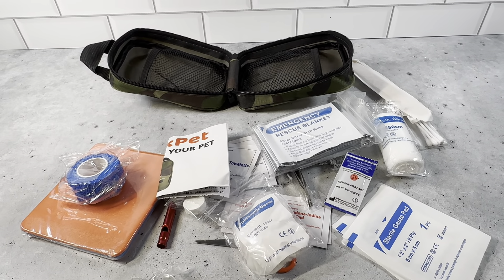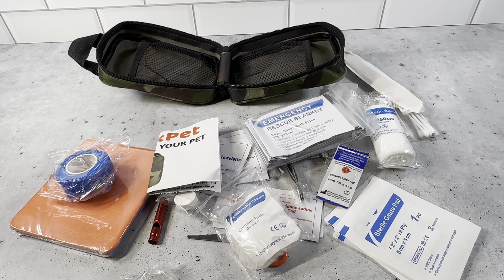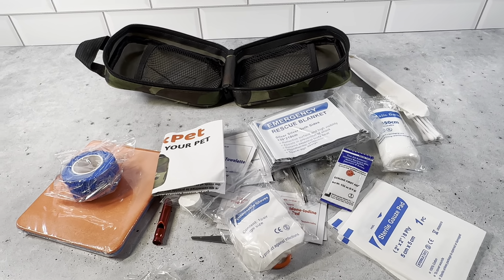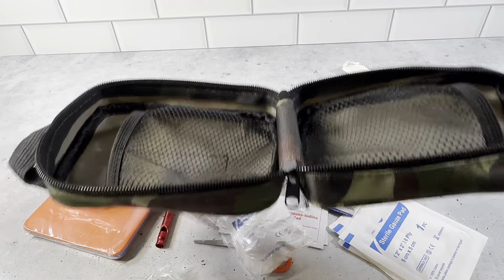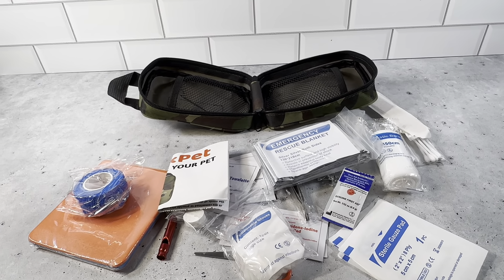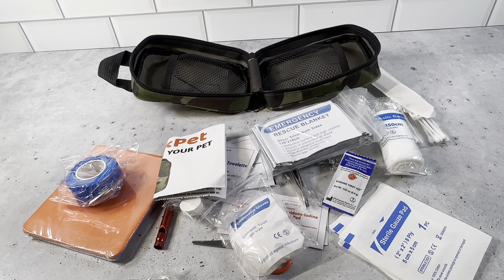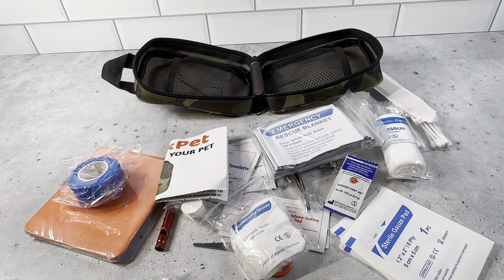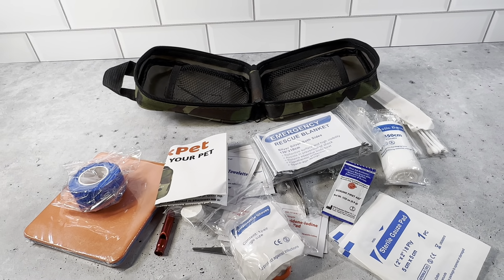You definitely want to pick one of these up, even if it's just for your house, or if you're spending time outdoors with your pet. This is a really nice set to have with you and it's very compact — it all fits in this six inch by three inch bag. The bag is super durable. When it opens you can just feel how nice it is. It's got the nylon straps. Highly recommend picking one of these up. This company Zeke Pet thought of everything you could think of for your pet.